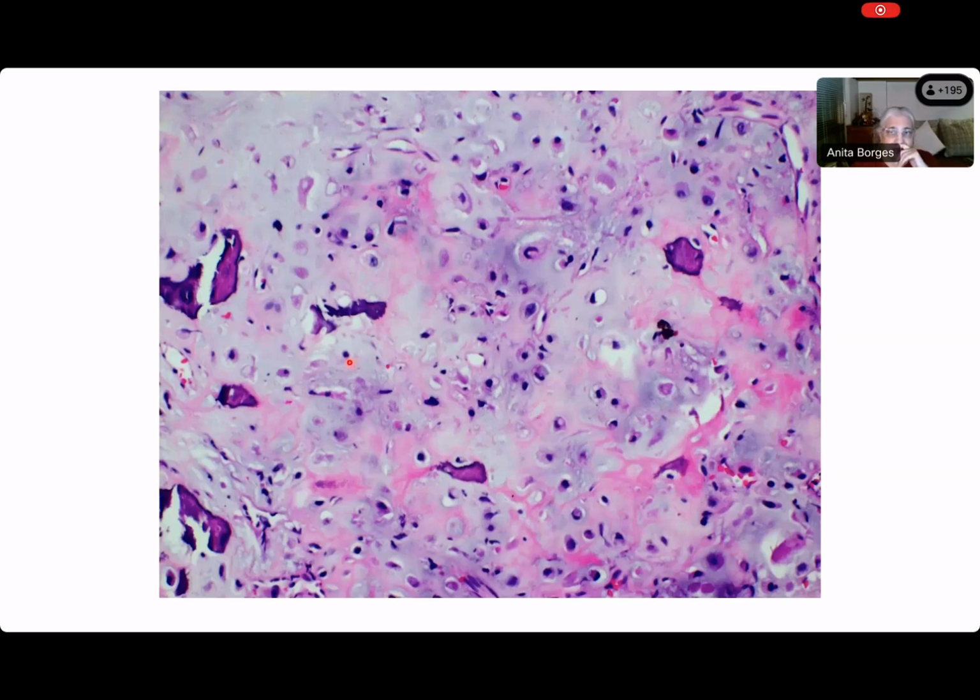So come on, tell me about the nuclei. The nuclei are small, round, hyperchromatic, and pleomorphic. Sarangi, are you looking carefully at the nuclei? I will ask each of your friends who are there whether they agree with you. These are small, round, and hyperchromatic. The only thing I will agree with you on is hyperchromatic.